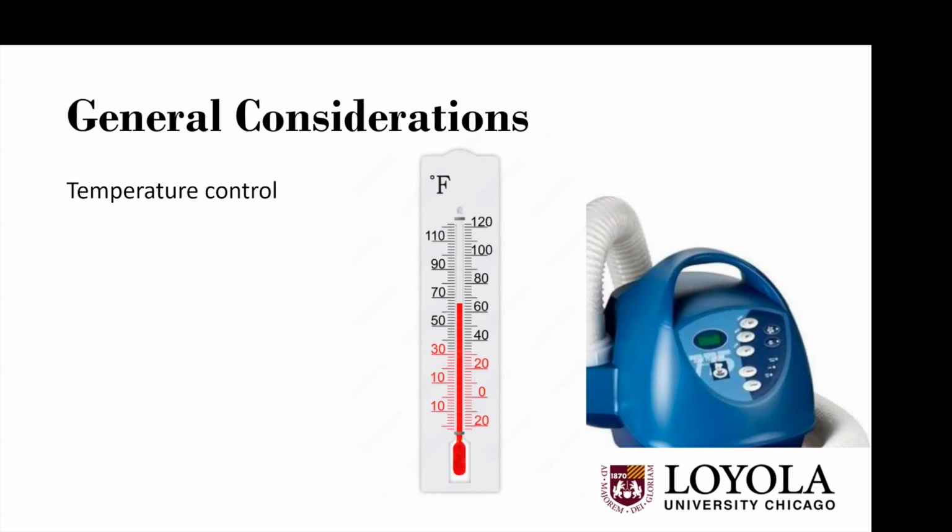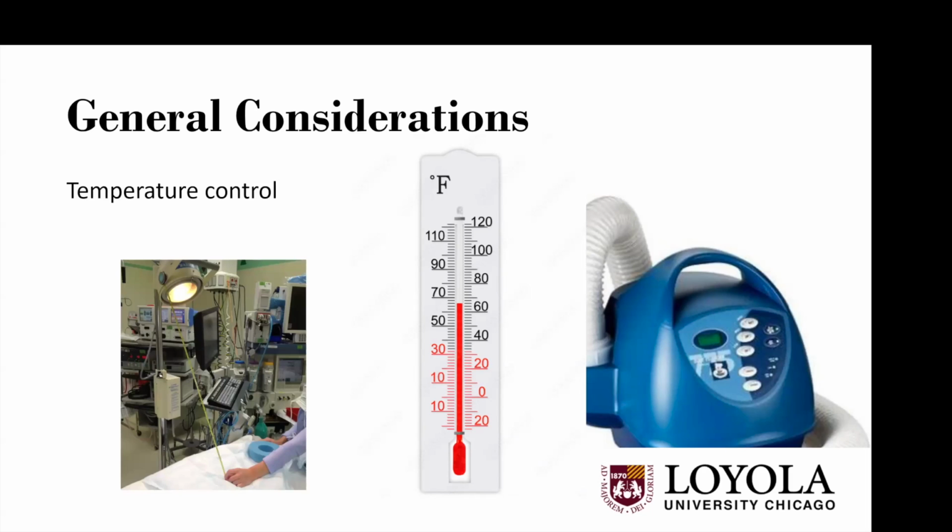If we are getting a neonate or a premature neonate, we usually add the warming lights, and they are available in the catheterization lab for us, and we turn them on before the baby is sent for. Usually it takes about 15 to 20 minutes for the baby to arrive, and usually the light warms the area quite well.